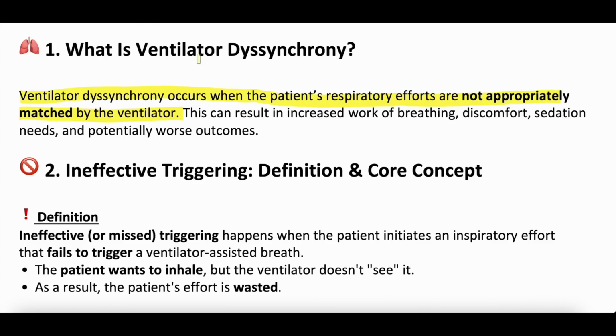This can result in all the things we've seen: increased work of breathing, patient discomfort, sedation needs, because sometimes folks sedate patients to make them more synchronous, and then potentially worse outcomes too. All these things can lead to prolonged ventilatory times or even ventilator-induced lung injury, all that kind of stuff.